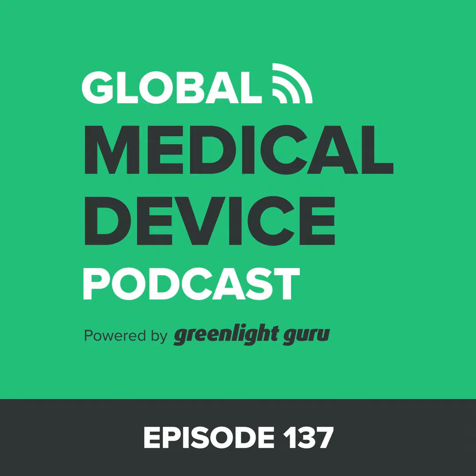We at R&D Group will develop our software based on Class B. And then if we have Class C software items, then we'll do the additional work that we need to do for those.